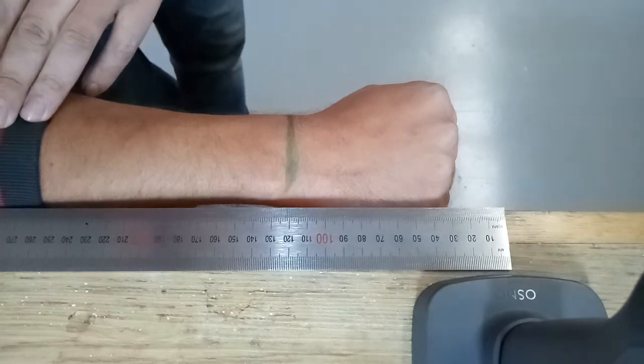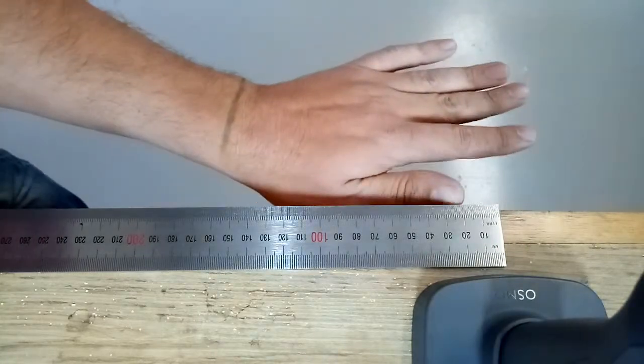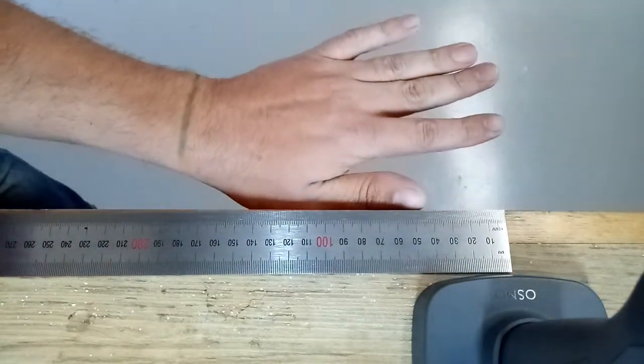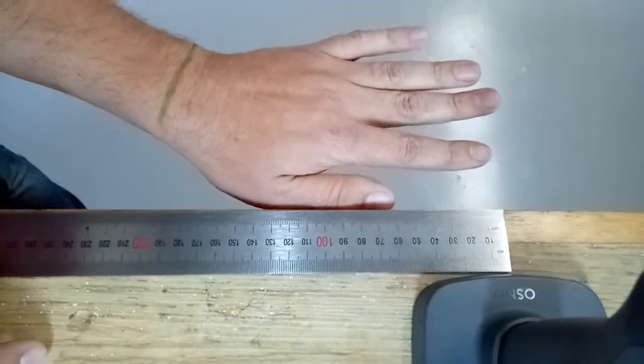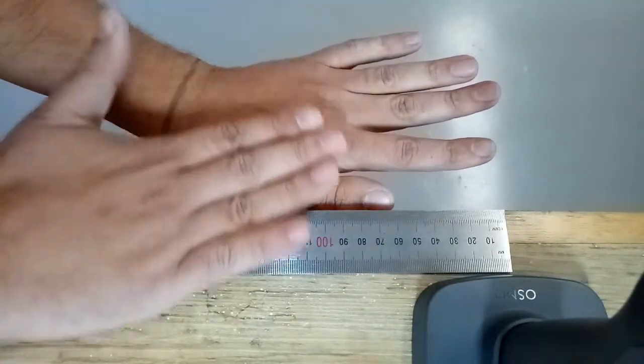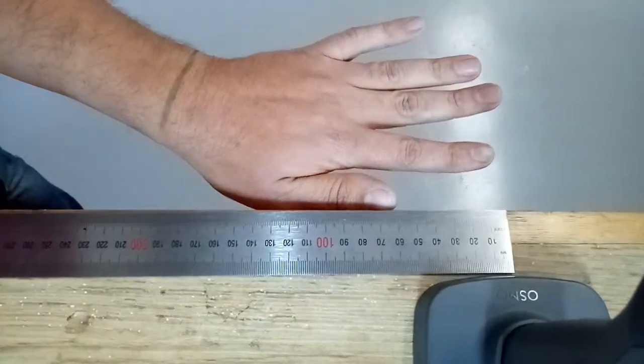For the second photo, we need the unaffected hand to understand the overall length of the 3D hand. Similarly, this needs to be at the same level as the ruler and taken from directly above.